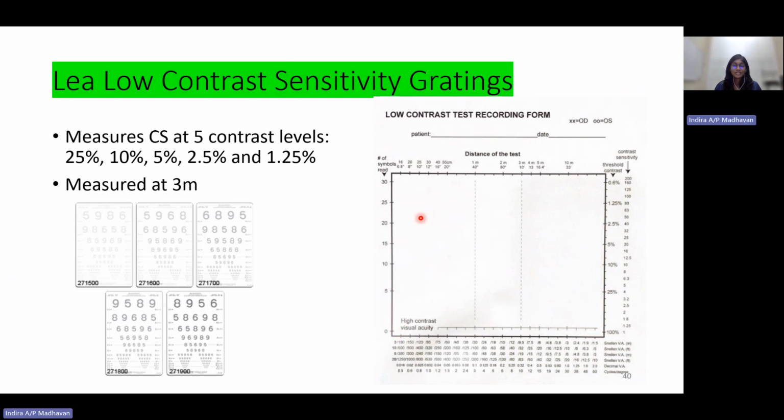So this is normal if, let's say, the patient is having cataract and also a fundus problem. That is the second example. They might actually have an even lower pattern in the graph. So from there, we will be able to know whether this patient, after the surgery, will have a good outcome or not.